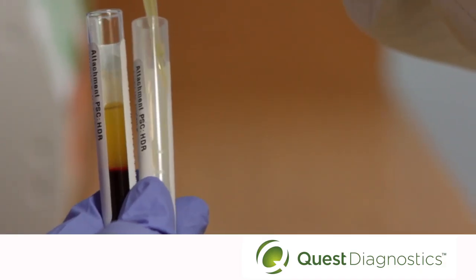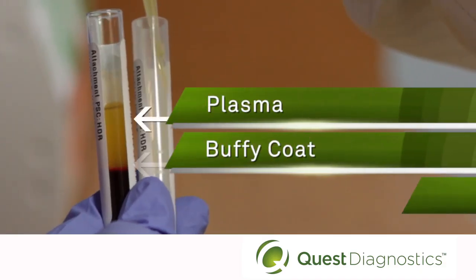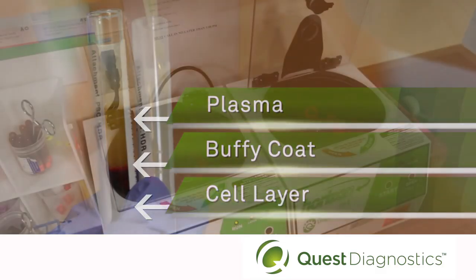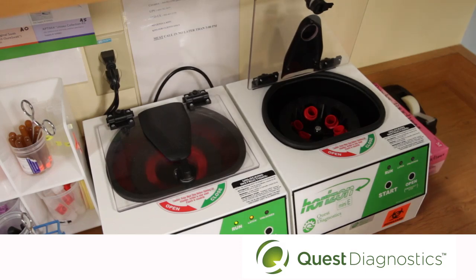Notice that you can still clearly define the three layers: the plasma, the buffy coat, and the cell layer. The plasma you separated goes back into the centrifuge for a second spin.